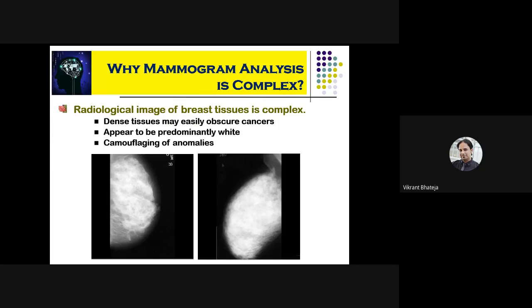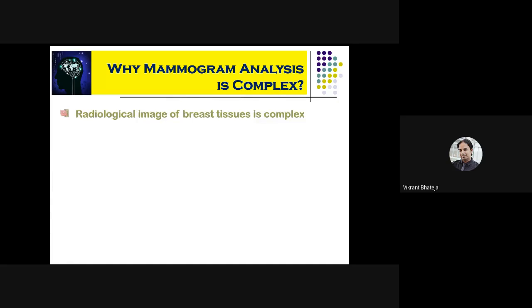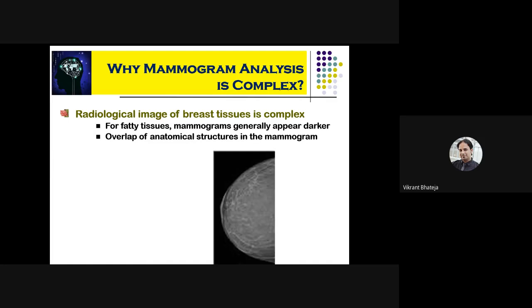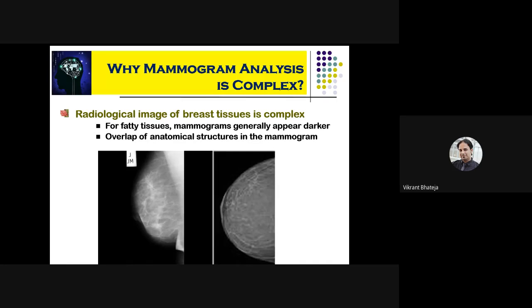You can have a view of these two kinds of images. These are mammographic images with a very dense breast region. You can see the high density of tissues over there. So there is a very slim possibility to detect or locate tumors in these types of images. Even fatty tissues or glandular tissues, like the other types of images we saw, are definitely better than the dense images.